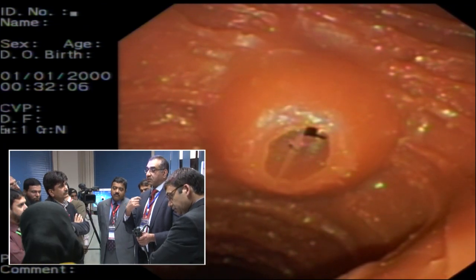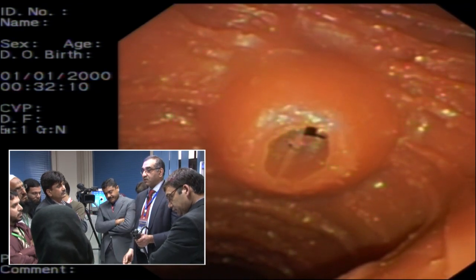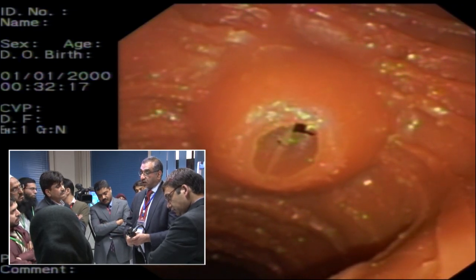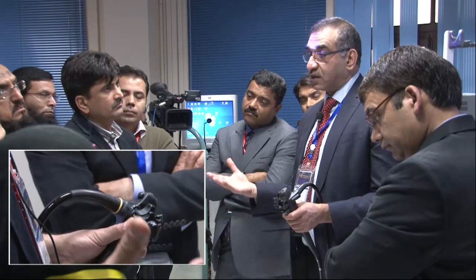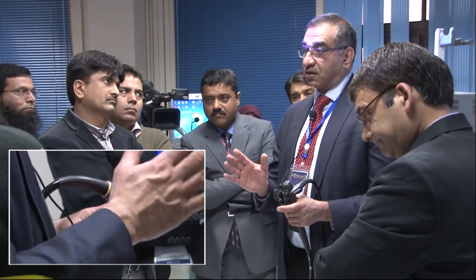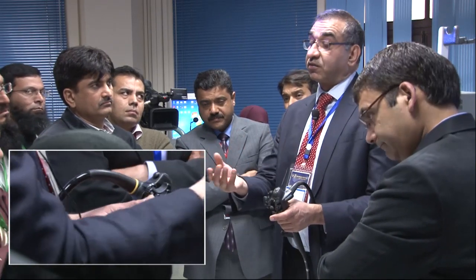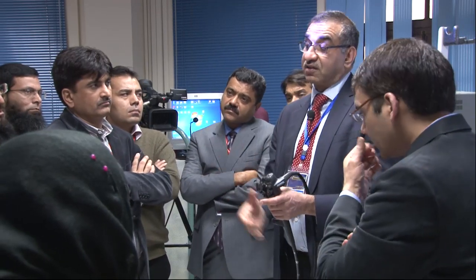And sometimes the guide wire is going to slip through, sometimes you might have difficulty in cannulation. The main thing is to stay calm. Because the moment you start panicking, the moment you start getting angry, you can't get your cannulation done, you can't get the work done, and the whole team gets panicky as well, and they can't perform. So always keep calm when you are in a tight situation. Whether it's a bleeder, whether it's difficult cannulation, or whether a guide wire slips through a difficult stricture, which we have spent quite a long time to get through, these things can happen.